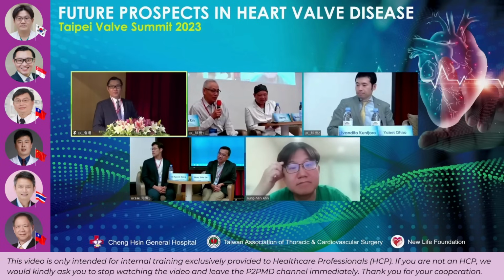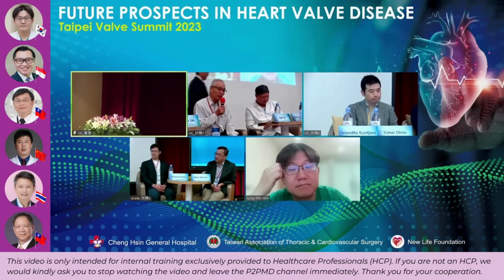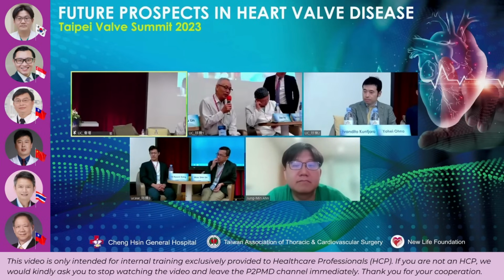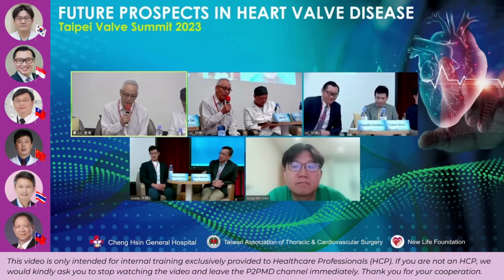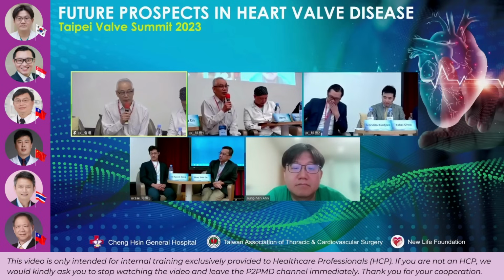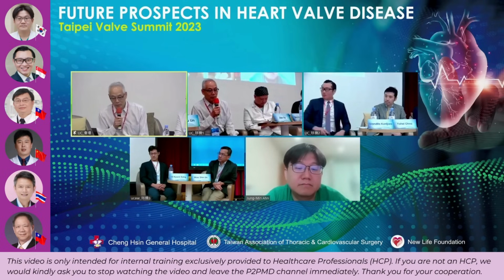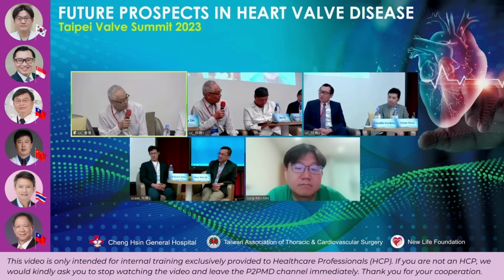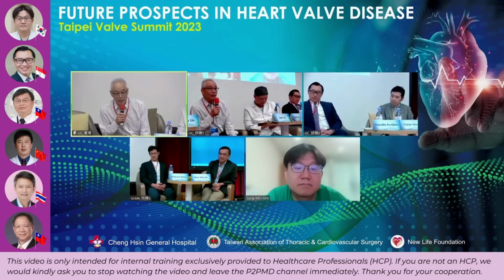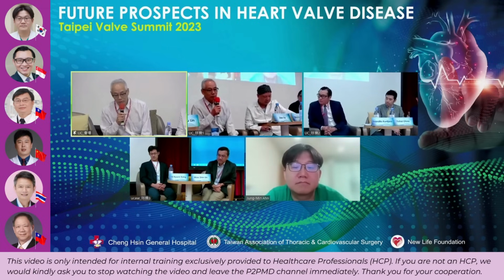My own experience is more with the Sapien valve, and I agree with Dr. Lin. I usually decide based on the annular size, but I really base it on the amount of calcification of the leaflets or annulus. I would usually undersize first, and then decide how much second balloon to use. That's how to make the decision, and that way you can really avoid annular rupture. Personally, I have never had an annular rupture for a bicuspid valve. I think that's a good strategy to reduce the volume, and then you decide how much you increase.